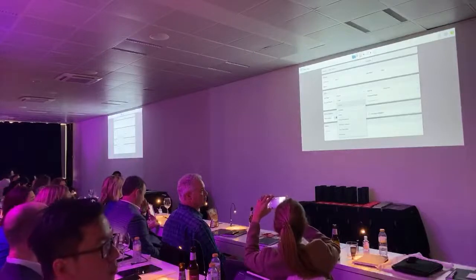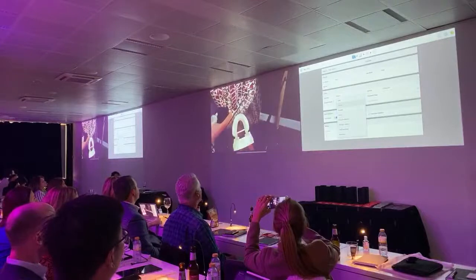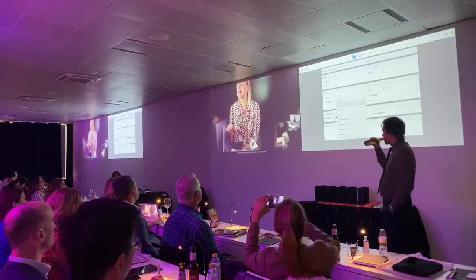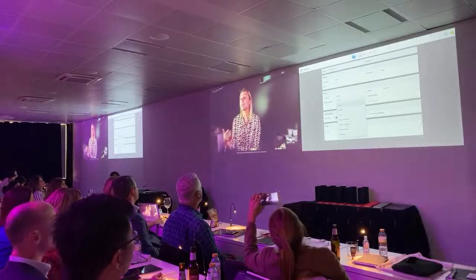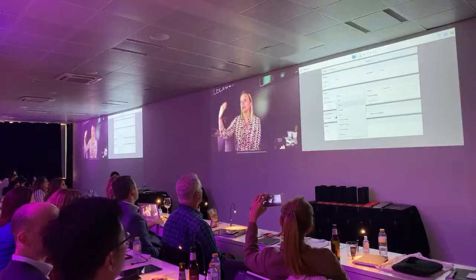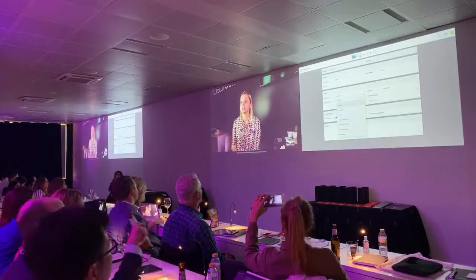The chair-side milling is when you will be able to download from your iTero account, the cloud, the scanning, and send it to whatever CAD system that your lab works with. The restorative solution, you will pass through Costa Rica, they will work on your mesh and send you back the STL, okay?